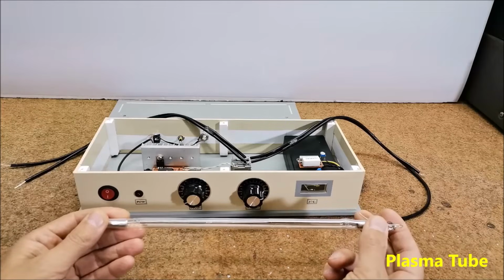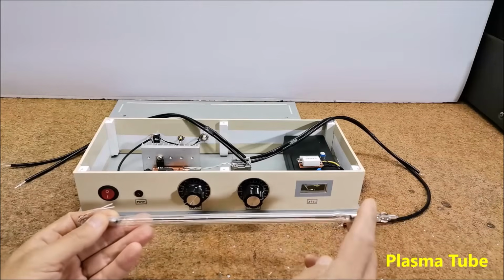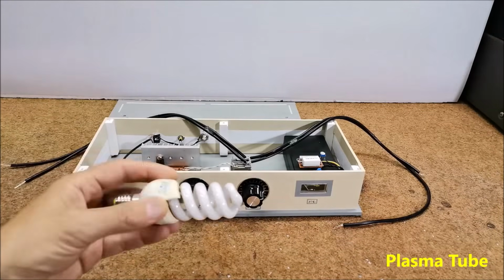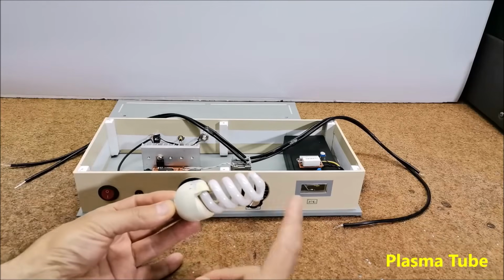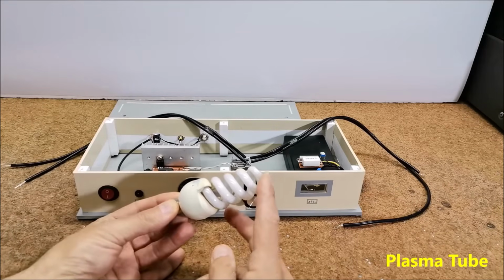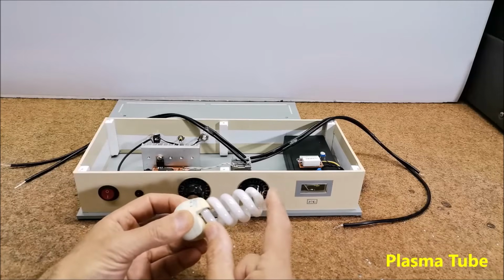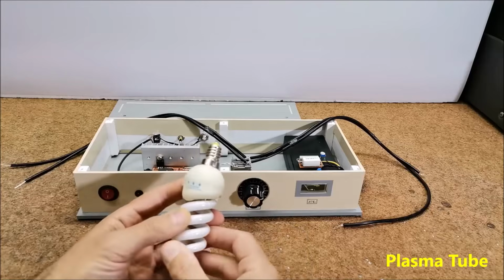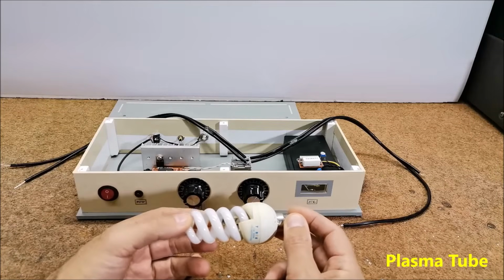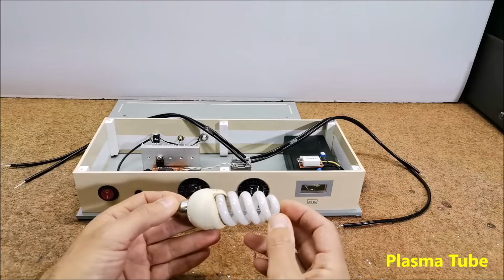Now I will reveal to you a big secret that does not work in favor of the manufacturers of such devices. Namely, Rife experimented with tubes filled with inert gases, argon, neon and mercury. Ordinary compact fluorescent lamps are filled with argon and a small percentage of mercury vapor, which until recently we used for lighting in our homes and can still be bought as old stock at a very low price. If we remove the electronics, these tubes are ideal for use in this particular case. The only drawback is that now the device will be less visually exotic and the placebo effect during the treatment will be weaker. Otherwise, its function is identical to that of expensive plasma Rife machines that are offered on the internet.